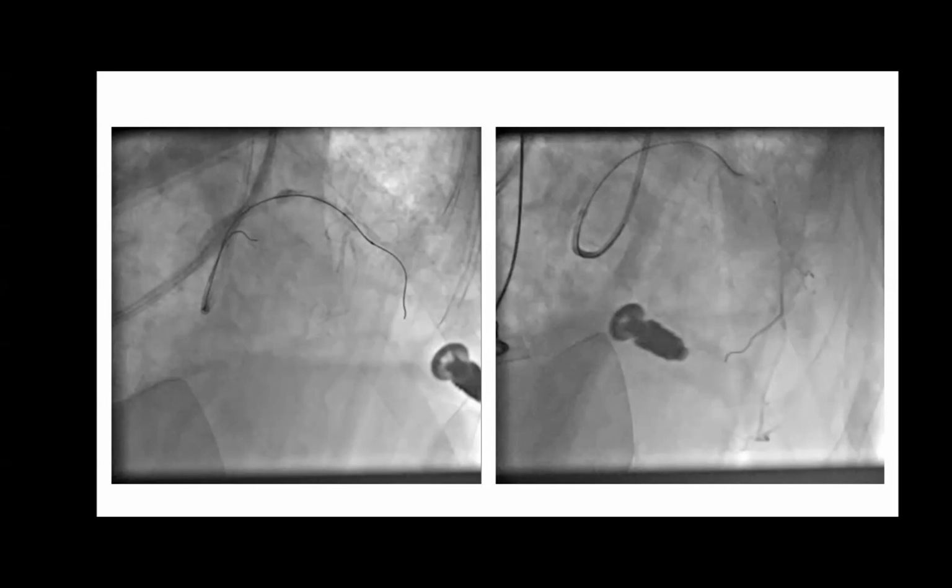Because CTO operators are very good at puncturing back, but that's in the CTO condition. Usually when you have an acute dissection and a bit of hematoma, I find that trying to puncture back into the lumen is not that straightforward, not that easy. Trying to find the lumen before the dissection or right from the ostium of the left main might work.